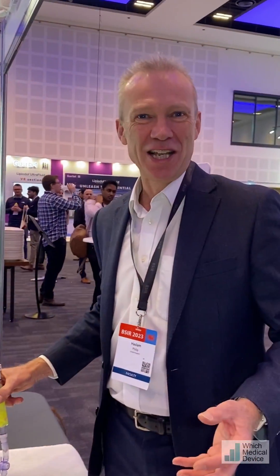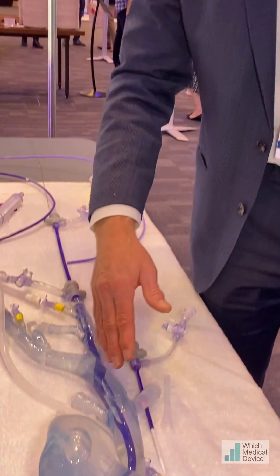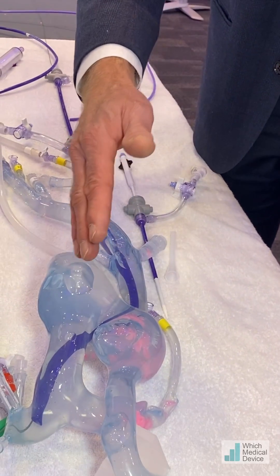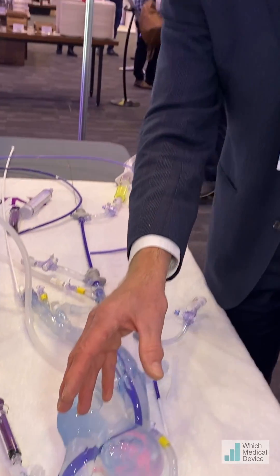If only it was as easy as that — well, it almost is — but sometimes it takes a couple of goes. The real skill with this device is actually getting it round into the pulmonary artery. It can be quite difficult sometimes to get it to track around through the tortuosity, even over a really stiff wire such as the Lunderquist.